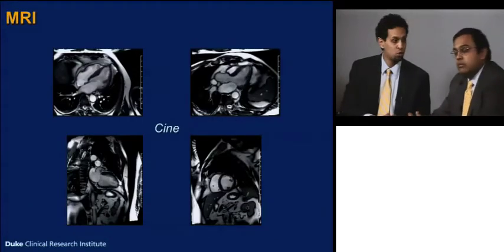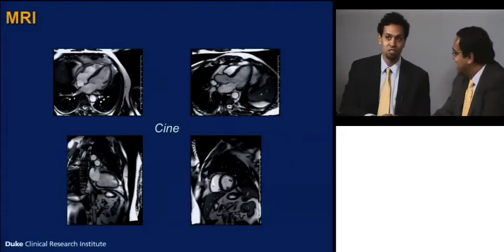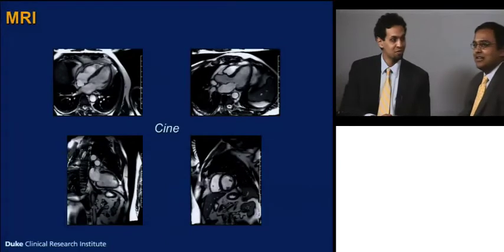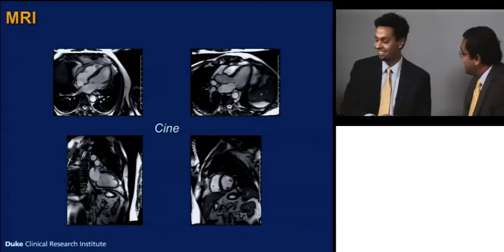So then they went to an MRI to get some more granular information to complement the nuclear study. But of note, we're now at 4 imaging modalities to take care of this patient with heart failure and potentially coronary disease. Yeah, I was going to mention that, in an interesting way, this happens in our heart failure patients. The patient got an echo, a chest x-ray, a cath, a V-gram at the cath, probably, and now a nuclear and an MRI. So at this point, we should know everything about their heart.